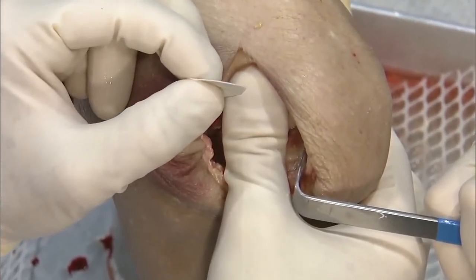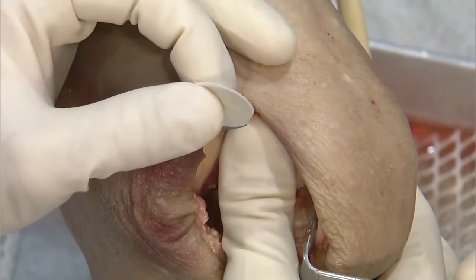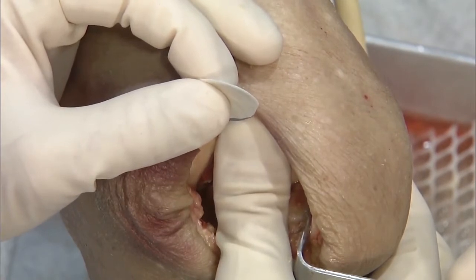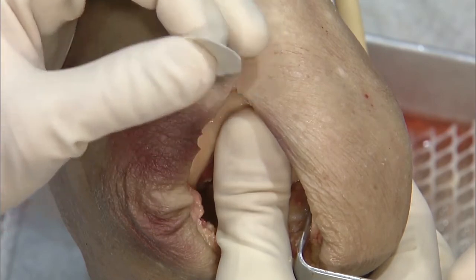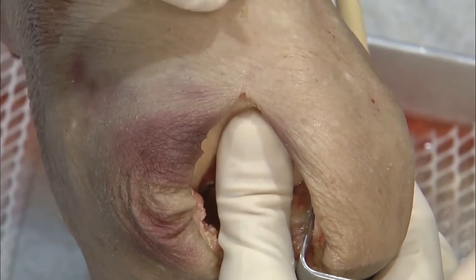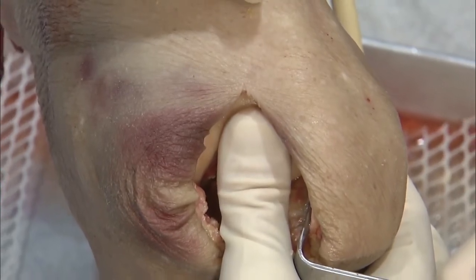This has given me a lot of confidence with rehabilitation. With the old ACI technique, we were very conservative, 6 weeks of toe touch weight bearing. We've definitely accelerated. Now the first 4 weeks are partial weight bearing, and then I let them go to weight bearing as tolerated in week 5 and week 6. I'll range the knee here for you in a minute once the glue is ready to go, but it gives you a lot of confidence that you could maybe even go quicker, especially with these well-contained lesions, with the implant at its base.